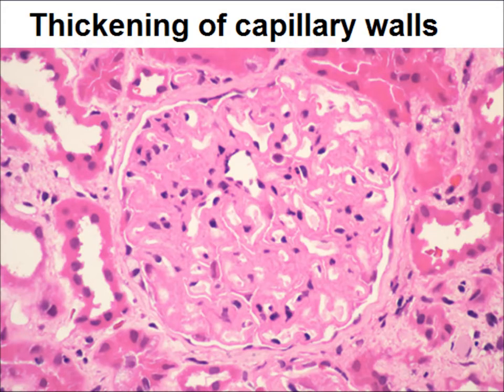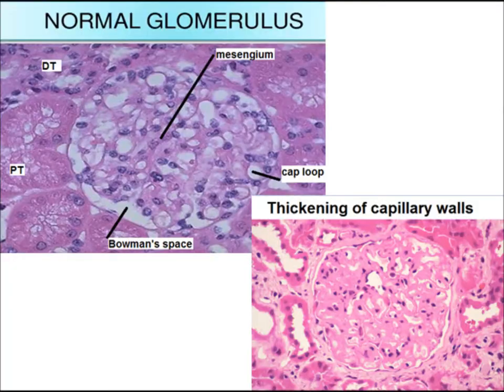In this photomicrograph, you can see thickening of capillary walls. The capillary walls are thickened, but there is no increase in cellularity. You can compare both photomicrographs — the left side shows a normal glomerulus and the right shows thickened capillary walls.